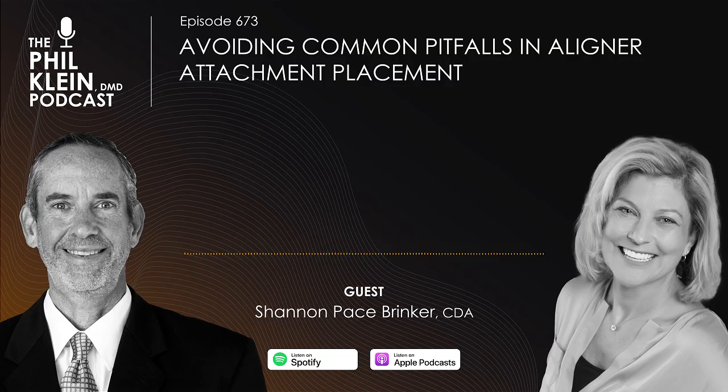Now, let me back up for one second if I can, Phil, because some practices pre-fill the template before the patient comes in, and they did not try it in. Now, that's, first of all, a thing for me, I'm kind of scared. I just don't trust that. I will fill it all after I've etched and I put the composite in all the attachment windows. But I will tell you that I want to slightly overfill it, because this is the reason why we don't get the movement we need. We didn't put enough composite into that attachment template.